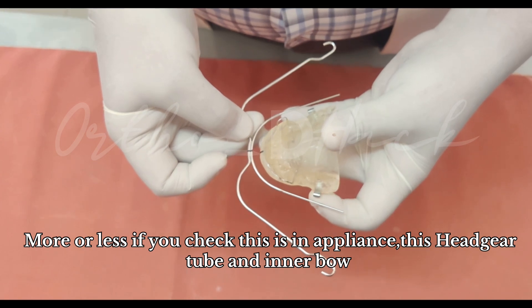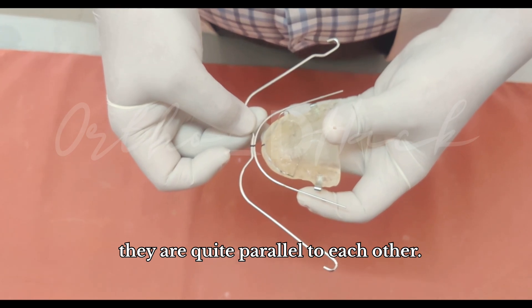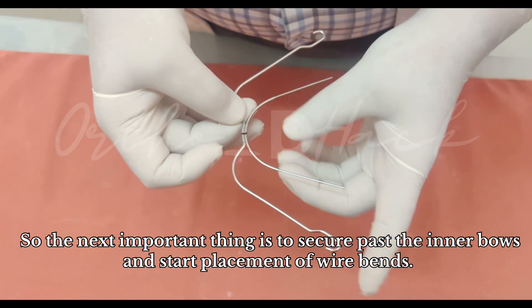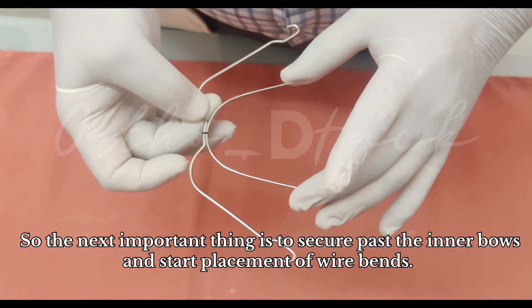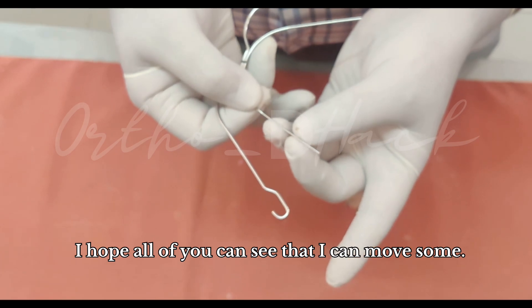In this appliance, the headgear tube and the inner bow are quite parallel to each other, which means they are in good coordination. The most important next step is to secure the inner bows and start placement of the wire bend — we start placing the bends in the wire.